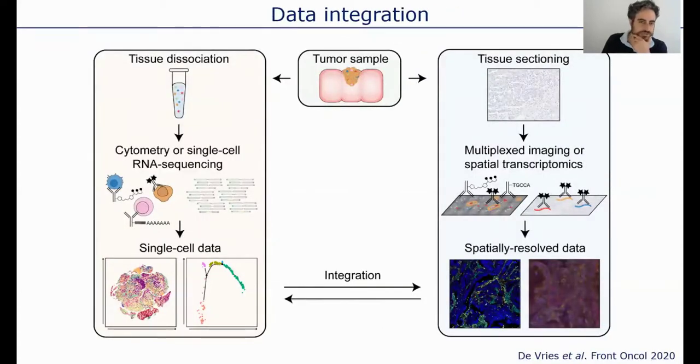In the coming years, we will probably be working very hard on the integration of data sets derived from different multiplex platforms, and we think that IMC can really play an important role in, for instance, supporting the mapping of single-cell data back to tissues.